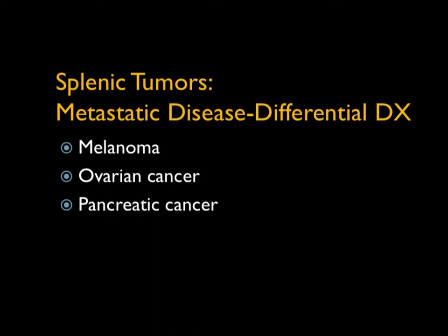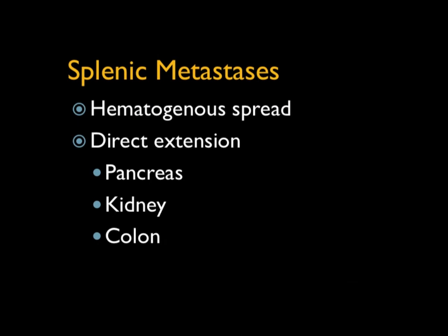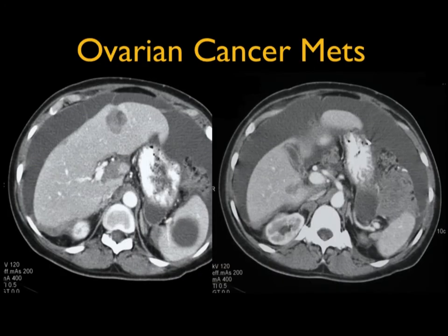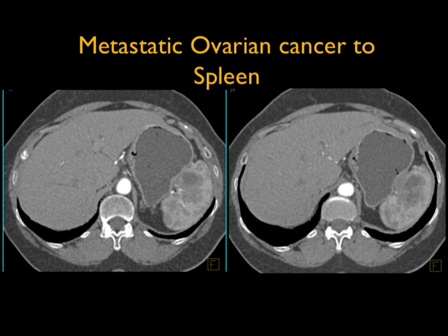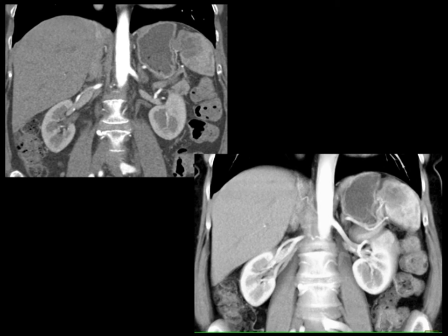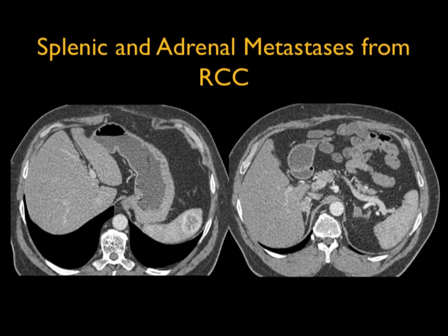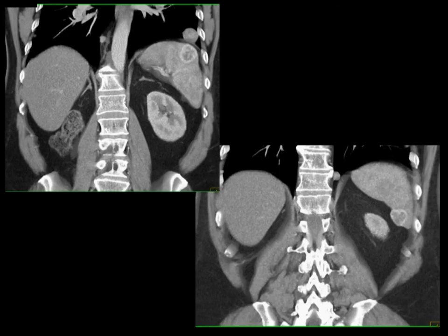When we talk about splenic tumors, we talk more about metastasis, but primary tumors like angiosarcoma do occur. When you talk about splenic metastasis, melanoma, ovarian cancer, and pancreatic cancer top the list. We talk about hematogenous spread and direct extension, which is more common for pancreas, kidney, and colon. Here's a good example of ovarian cancer with widespread ascites, implants on and in the spleen and liver — very much classic ovarian cancer. Another example shows mass on the surface of the spleen growing directly into it. Here's an example of splenic metastasis in a patient with renal cell carcinoma — particularly clear cell type has vascular mets, which can occur though uncommonly in the spleen.